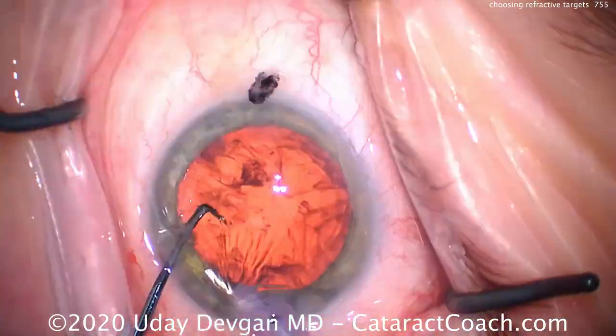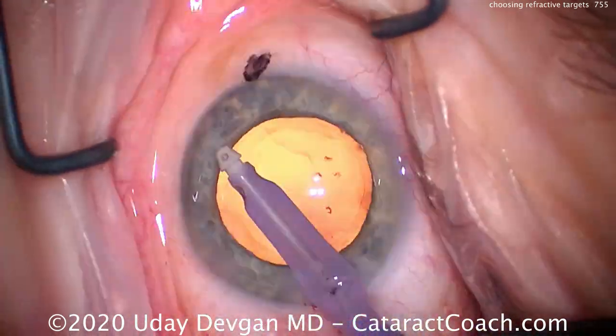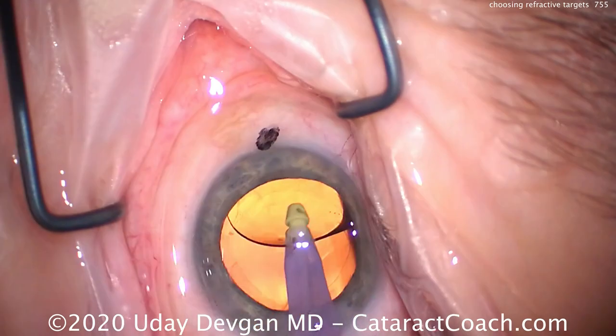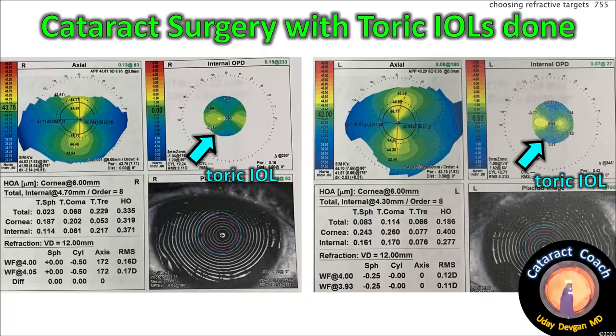The nucleus and cataract removal goes well, no issues at all. Clean up all the cortex, time to insert the IOL. There's the lens going in the capsule bag, dialing it into the correct meridian. Post-op: toric lens beautifully centered and rotated to the correct axis, very nicely balancing out the cornea.